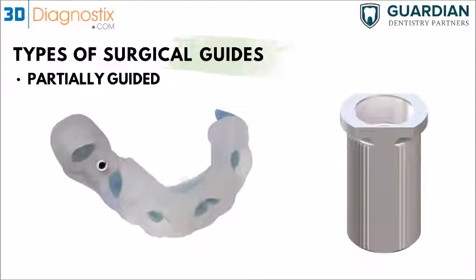Now we're going to talk about the guidance. So we've got two types of surgical guides. We have a partially guided surgical template and a fully guided template. So partially guided meaning that it's not going to provide you with all the guidance. So it could provide you with only depth, angulation, but you're not going to have sequential drilling. Or even if you have sequential drilling, you're not going to have implant placement control.